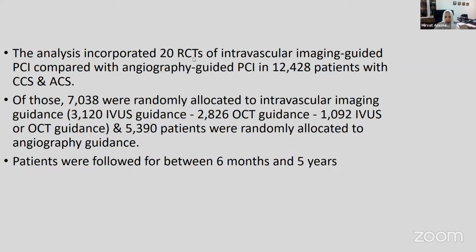20 randomized trials, 12,000 plus patients were included. Sorry, 7,000 were allocated to intracoronary imaging, of which 3,000 plus were IVUS, 2,000 plus were OCT, and 5,000 were angio only. And they followed them up between 6 months and 5 years.